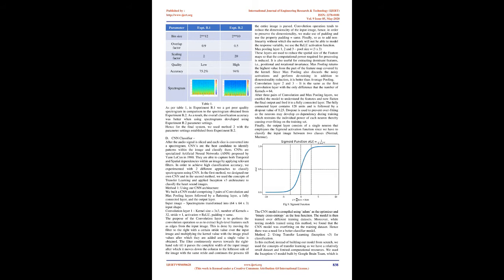Method 1, using the specgram method of the SciPy library. The SciPy library in Python includes a specgram method that allows us to create spectrograms after reading an audio file. Fig 8. Spectrogram obtained from method 1. Issue: firstly, this method did not provide much flexibility to experiment with the window type, size, and other trade-off parameters. Secondly, it produced poor quality bluish spectrogram and thus the overall classification score was low.